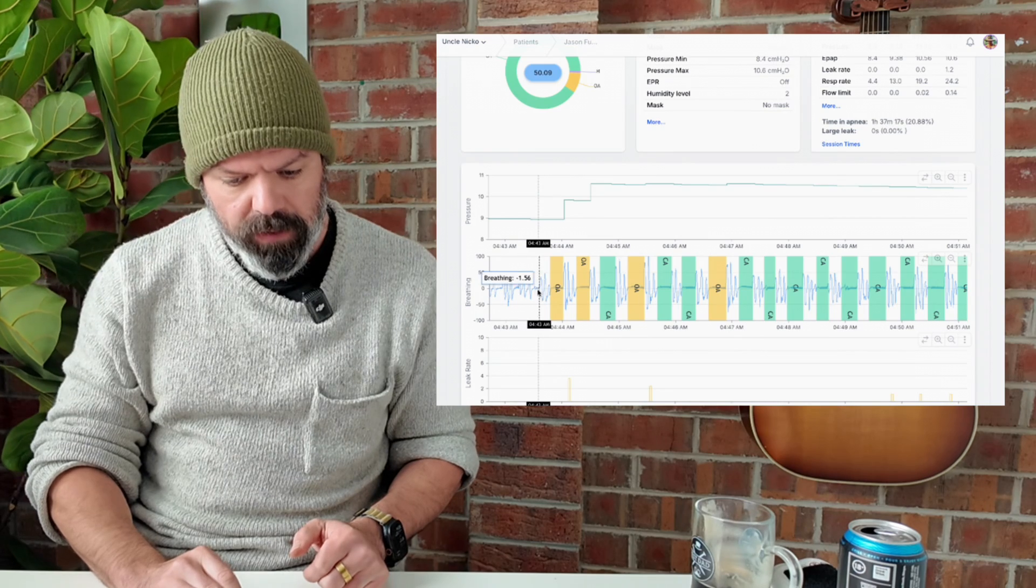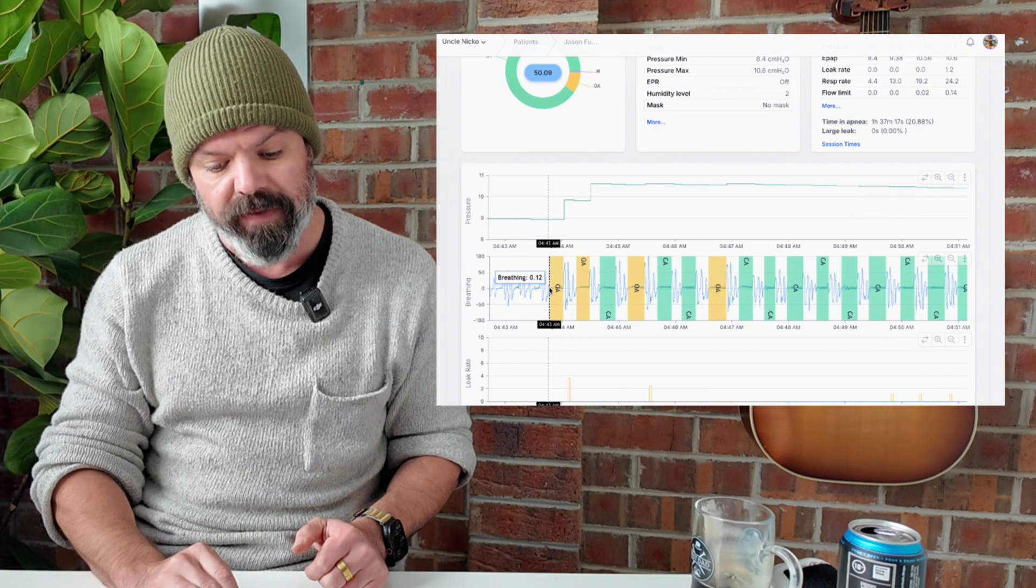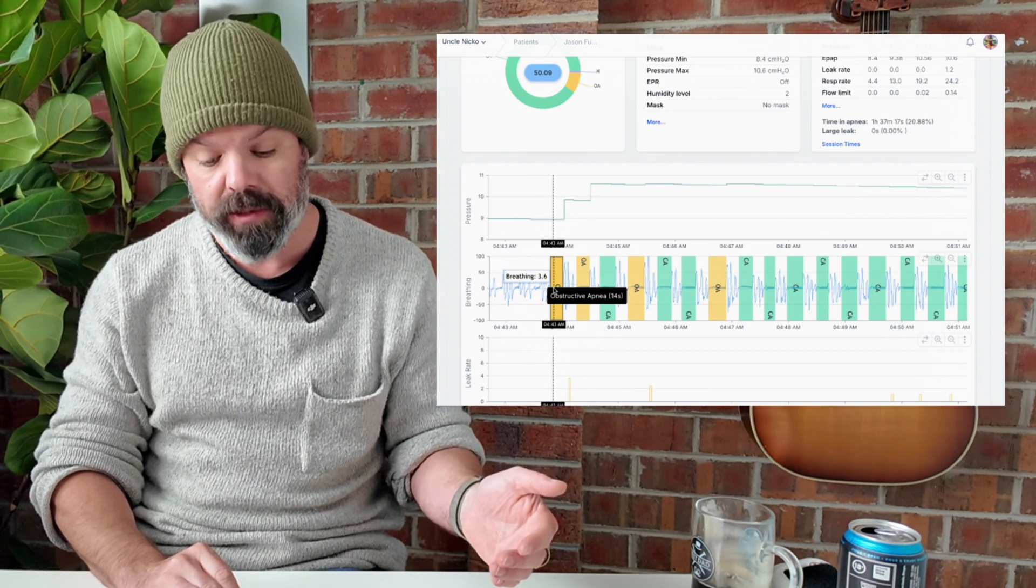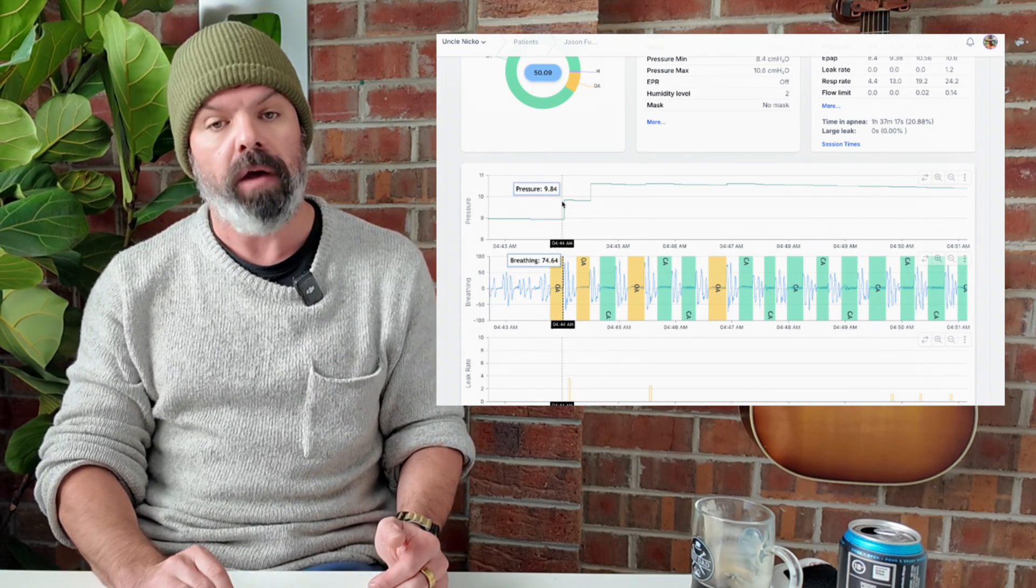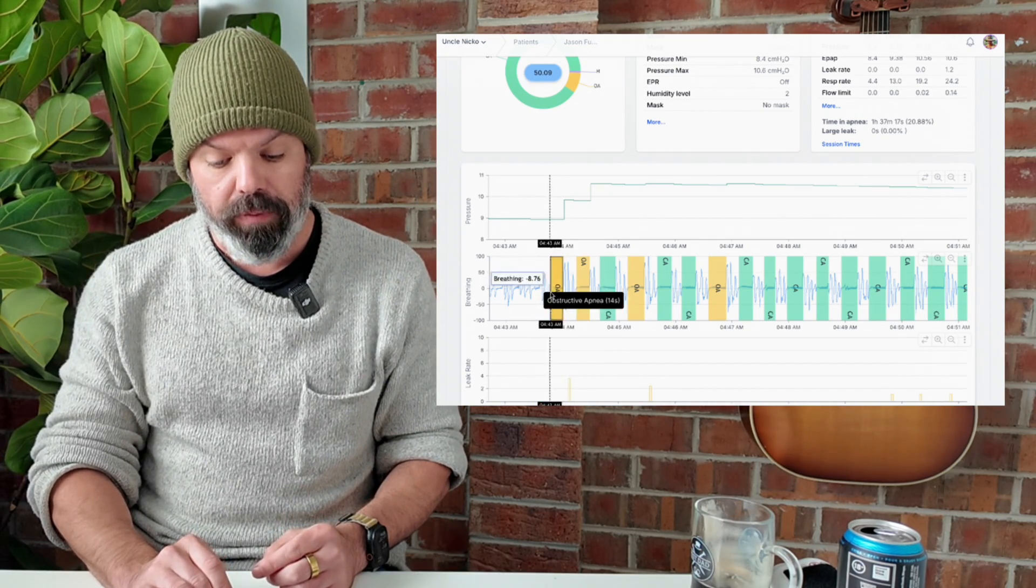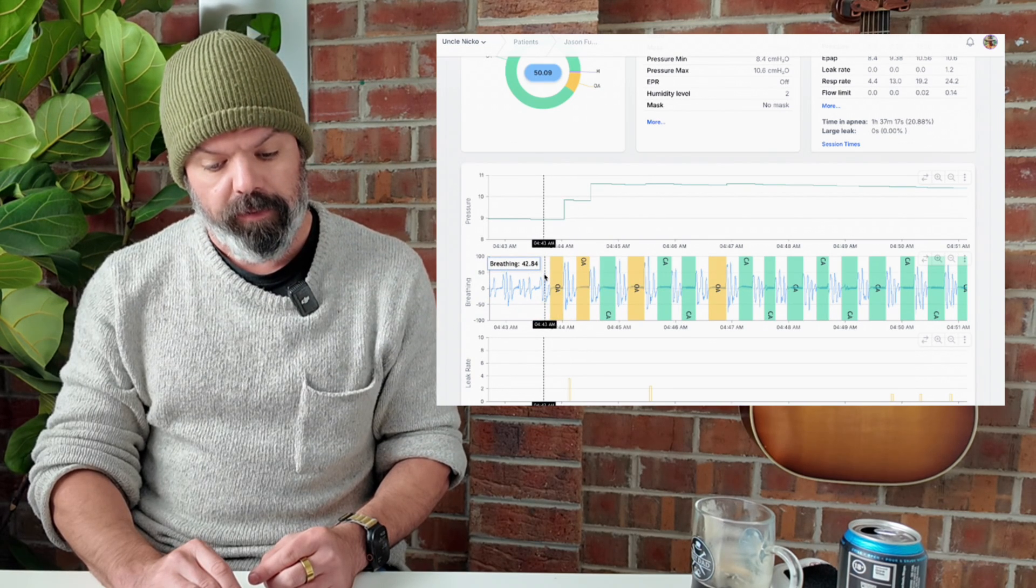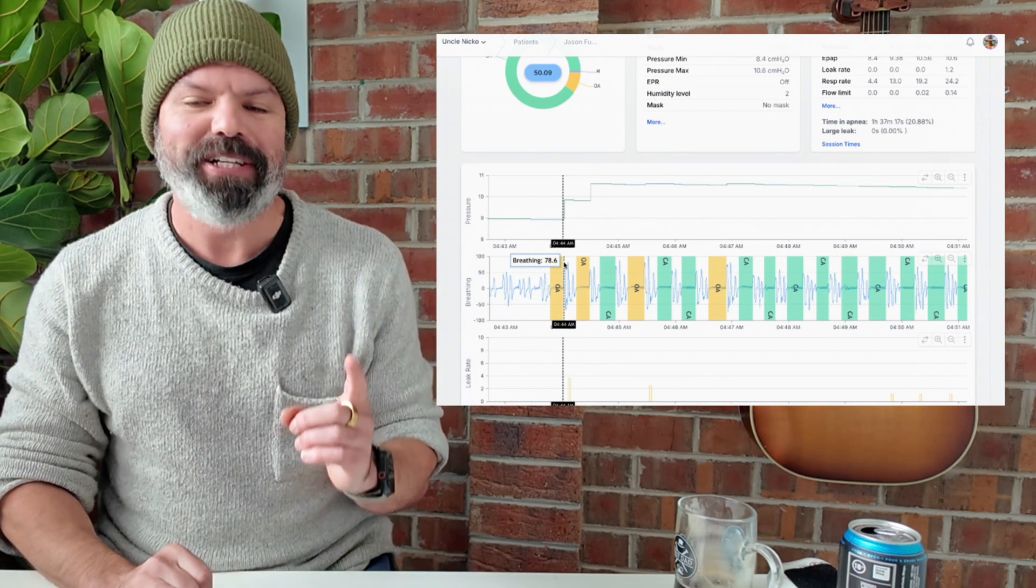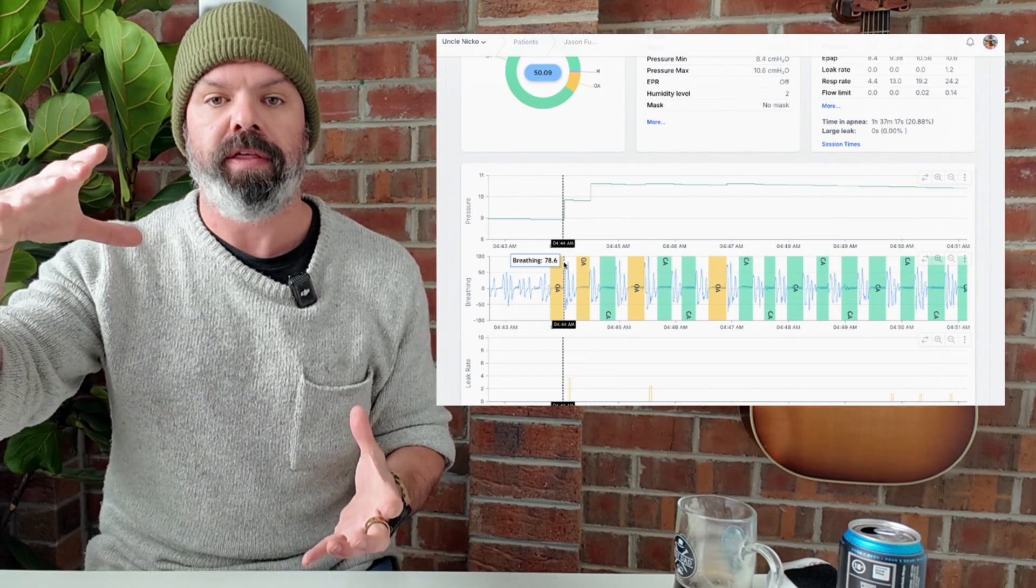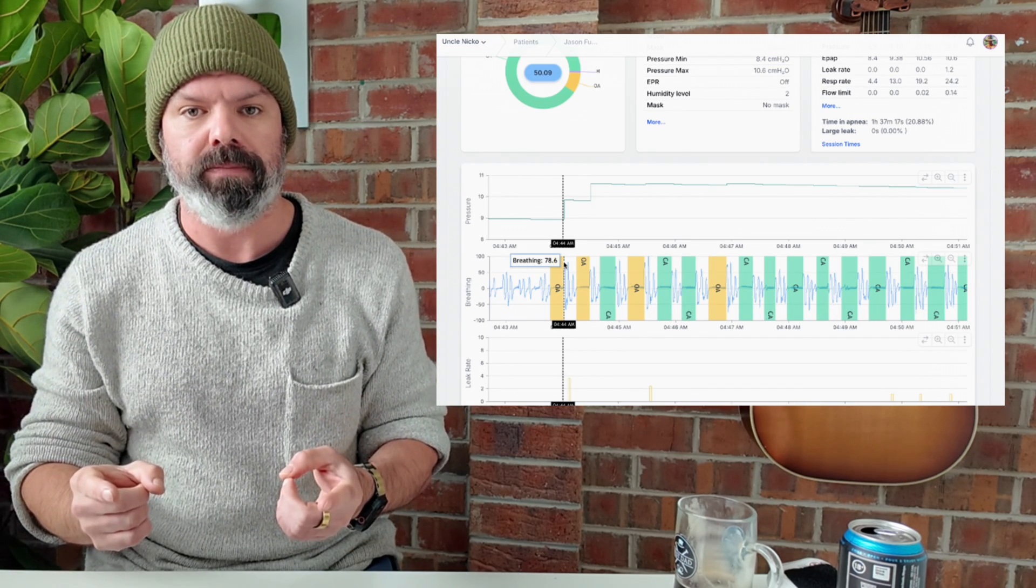So have a look at the breathing here. Look at the amplitude of the breaths. We get this incorrect flag, they're saying it's obstructive apnea, it's not, it's central apnea. The pressure jumps, look at this, 8.94 to 9.84. Only one centimeter, it's a decent jump. Look what it does to the breath. Look at the size of the breath now. Over here it was what, 42? Now look at it up here, 78. So that one centimeter jump in pressure has essentially doubled the size of the breath.